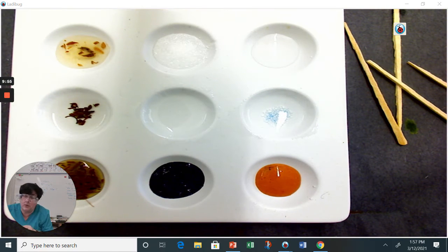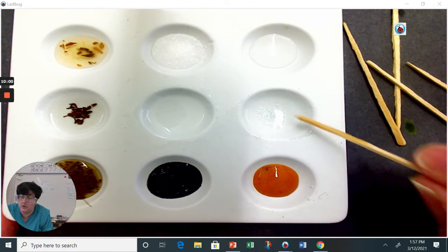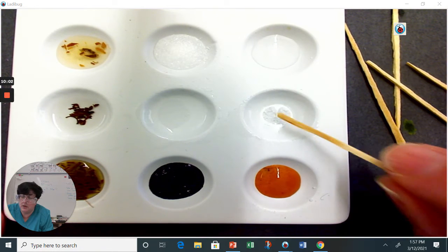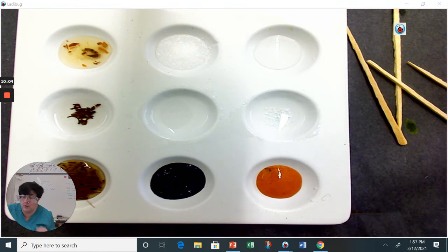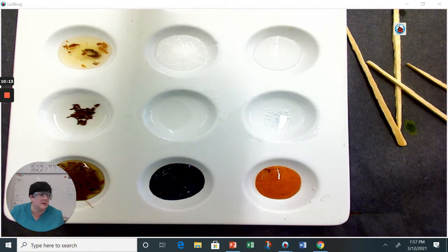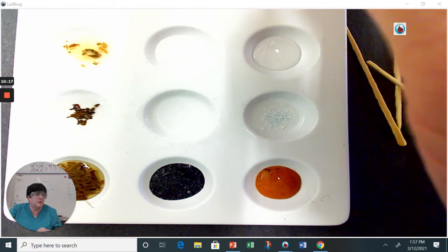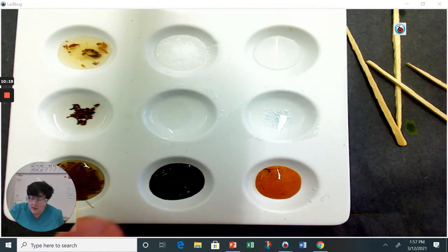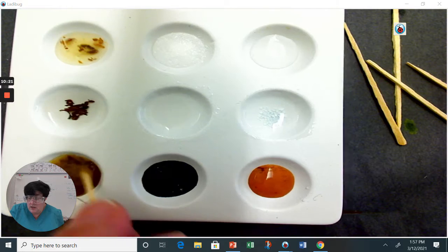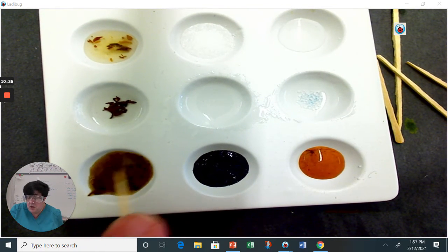Okay, so if I were to give you an unknown white powder and you checked it with a Scott reagent and it turns blue, you'd say, oh, look, that looks as if I have cocaine present. It seems to work better if I leave it alone. As it sits, you can see the reaction happen. I'm going to get rid of the glare. You can see that little bit of blue that starts happening. Now on these, this changes the color again. It seems like this is reacting with the organics that are there. It's making it very muddled in color.